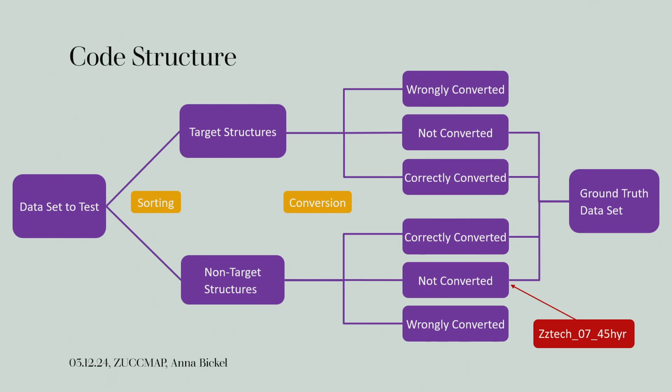And we make a ground truth data set, which is a JSON file with a dictionary, where you have the converted name, and then all of the names that were converted to it. So you could have PTV plus 4 millimeters, but you'd be astonished there are like 7 ways of writing that. It will always be converted to the same name, but it has different translations, I guess, which were the original names.